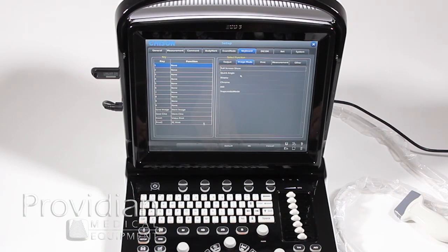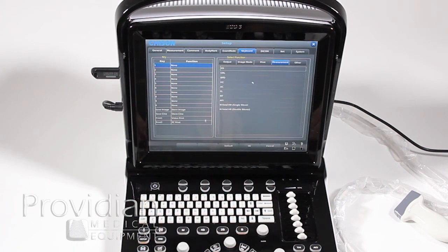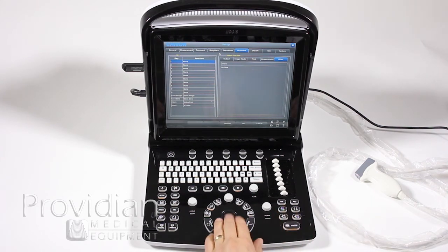Go to full screen, do a quick angle, biopsy. You can have it print. You can have it pull up a specific measurement. So say you want to just hit 1, 2, 3, 4 and go head circumference, abdominal circumference, femur length, and BPD. And then here's just some other things. And these are all things that you can assign to the print keys, print 1 and print 2, and also the save keys, the cine, and the store. Up here and over there. Those are the program.